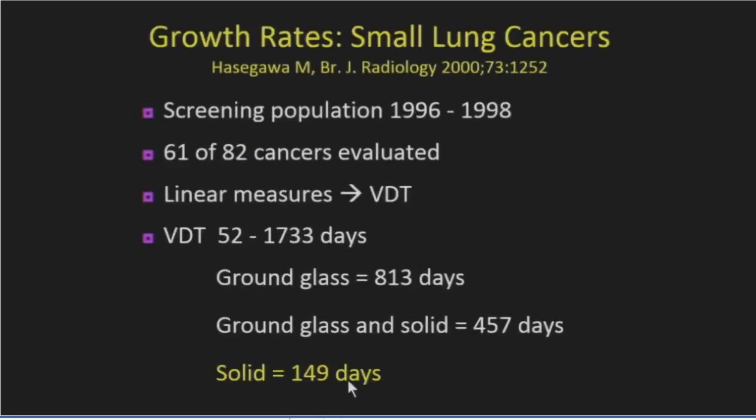So now moving on to nodule growth. Nodule growth, once we measure size, can be compared over time. And change in nodule size over time can be used as a way to differentiate malignant from benign.